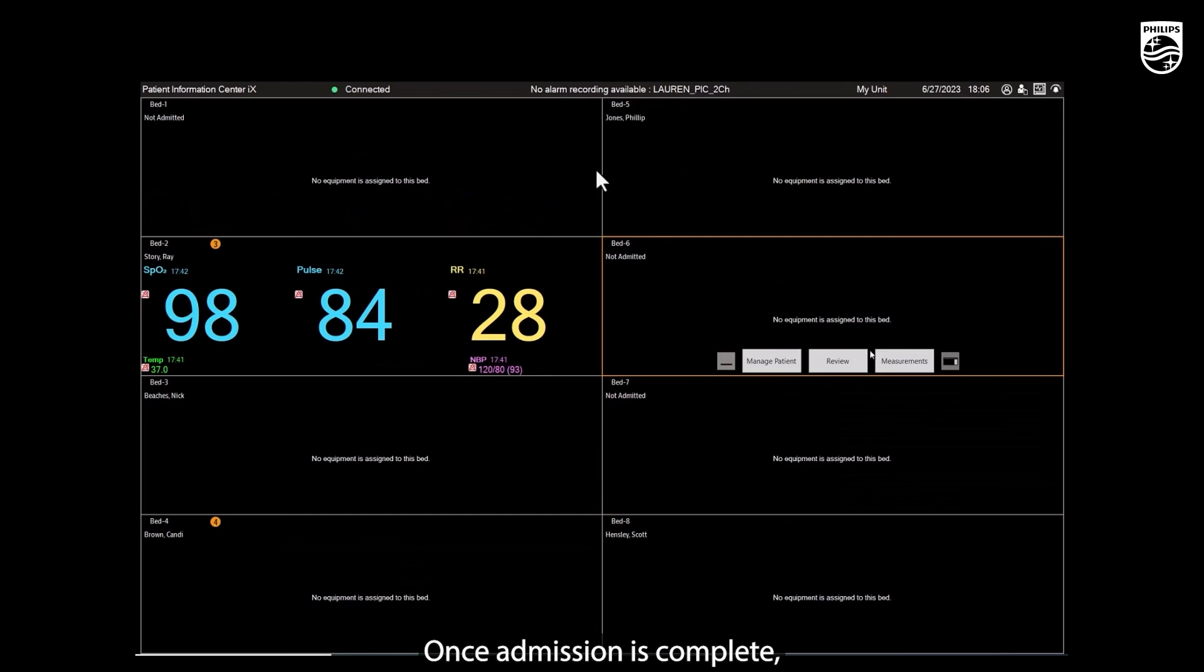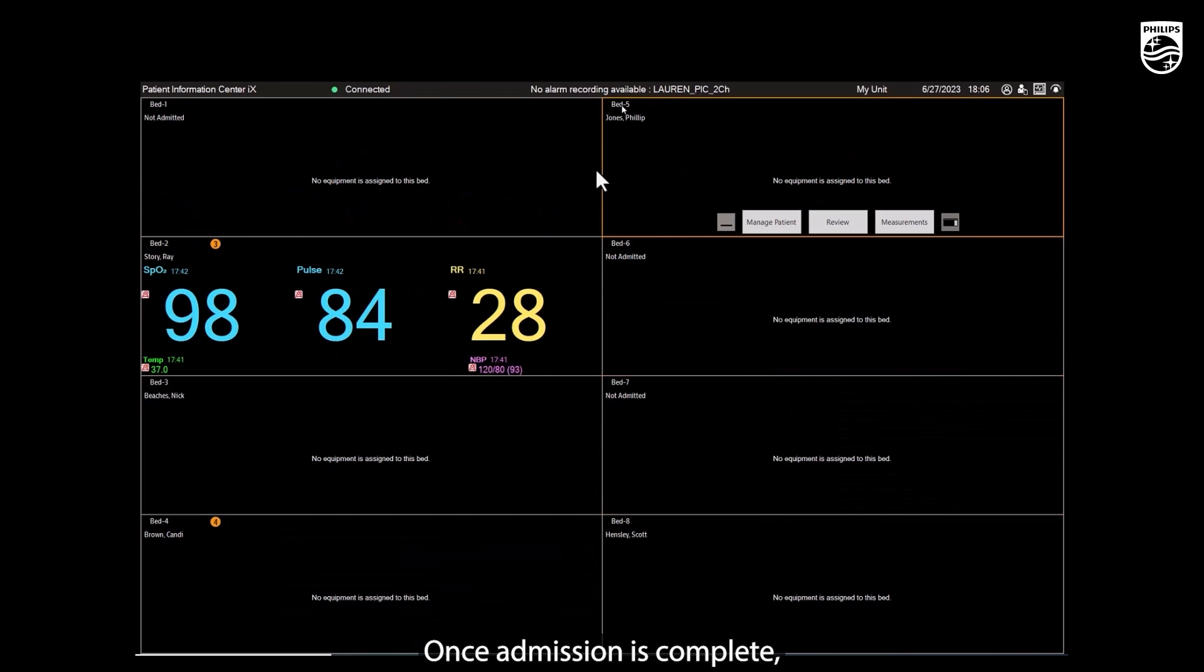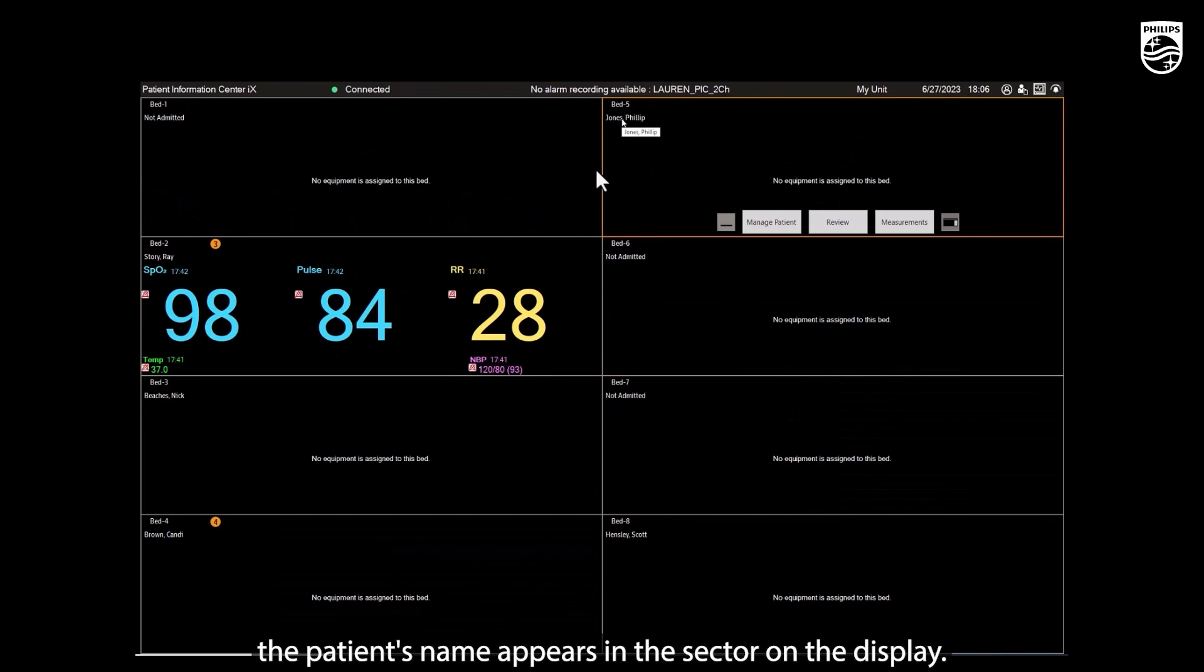Once admission is complete, the patient's name appears in the sector on the display.